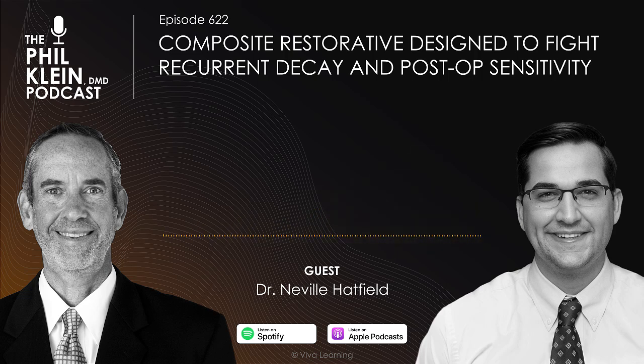Glass ionomers wash out, which is why a lot of our cements went from just glass ionomers to resin modified glass ionomer, because that resin holds those components in place. And every single time our patients brush their teeth or eat a certain thing or their saliva washes over these materials, they basically recharge these ions.